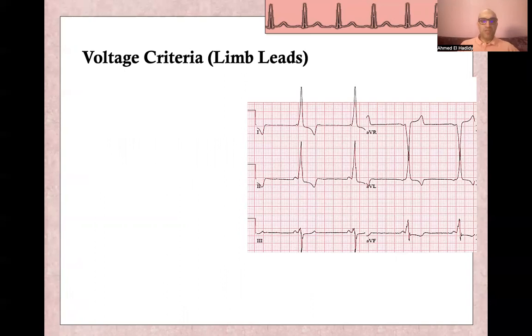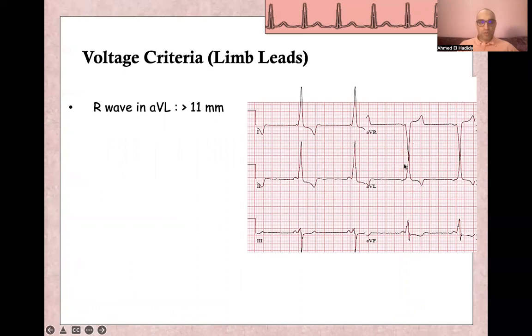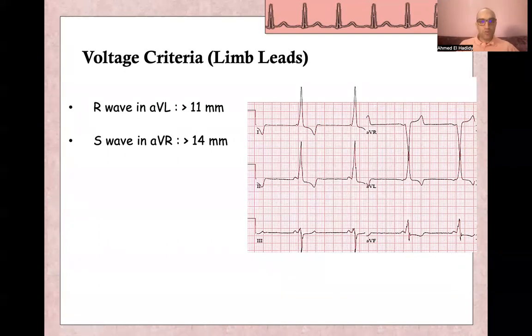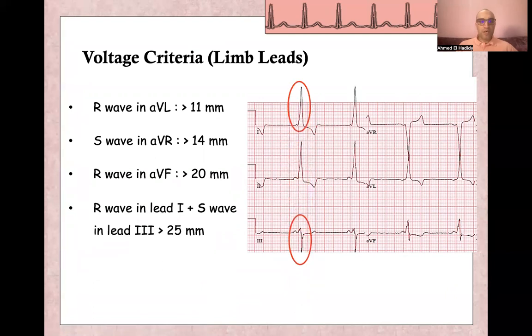Starting with voltage criteria in limb leads: R-wave in lead aVL should be more than 11 millimeters. S-wave in lead aVR should be more than 14 millimeters. R-wave in lead aVF should be more than 20 millimeters. R-wave in lead I plus S-wave in lead III should be more than 25 millimeters. Here the S-wave is almost 11 millimeters plus the R-wave which is more than 15 millimeters, totaling more than 25 millimeters.